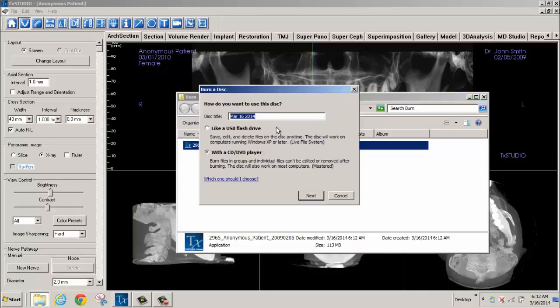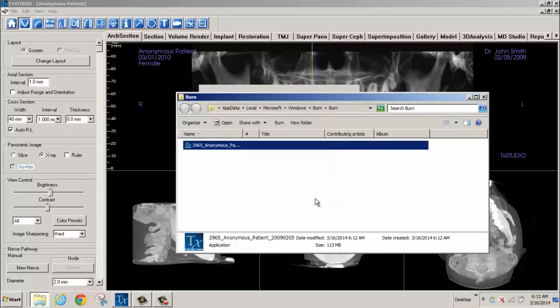The Burn a Disk pop-up window will appear. Check or accept the defaults and select Next.